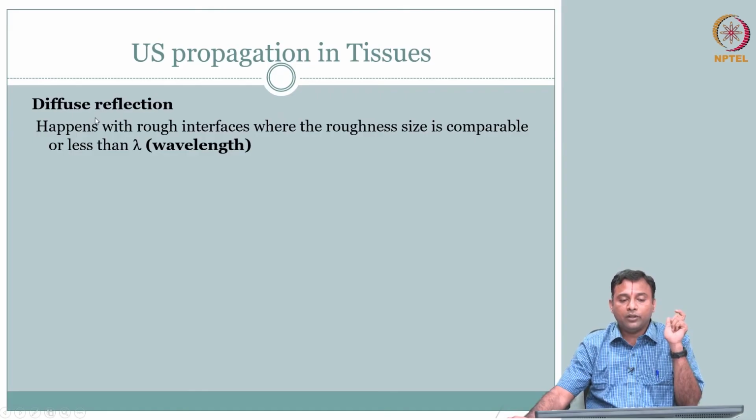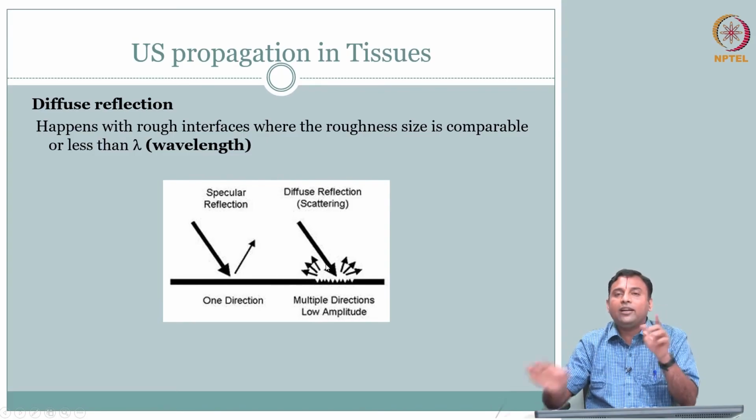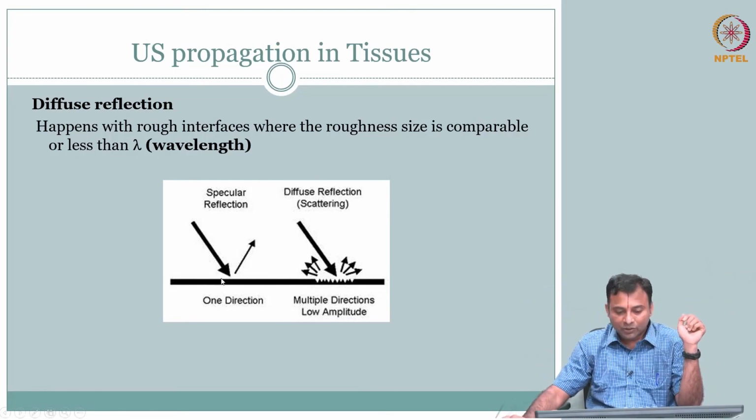That is the case we call diffuse reflection or scattering. Two things that you see: this is what we saw, theta I, theta r. Whereas here, notice theta I, no theta r. It is going in all directions, that is why it is called scattered. Notice here it was flat, whereas here you have imperfections, you have roughness.